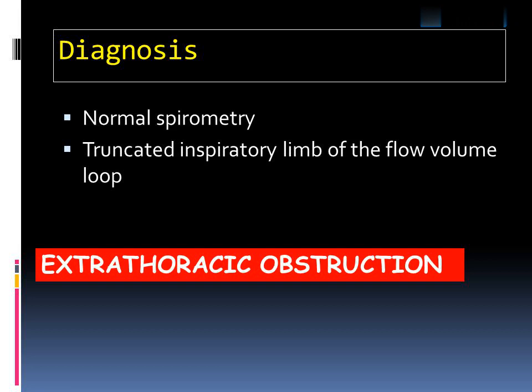Inspiratory limb of the flow volume loop. Extrathoracic obstruction.